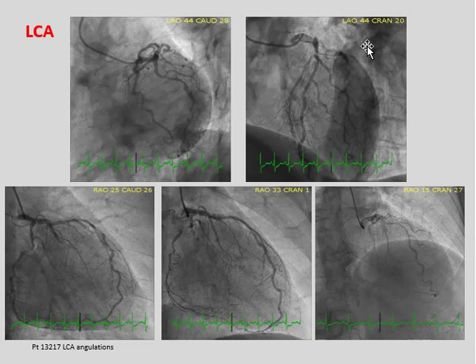Look at the LAO cranial. The football is still standing on its head, but it's rotated laterally completely. This is the LAD. How do I know? The LAD has these branches coming off it, the septal perforators and the diagonals. You can't really see them there, but by changing views you can identify them.